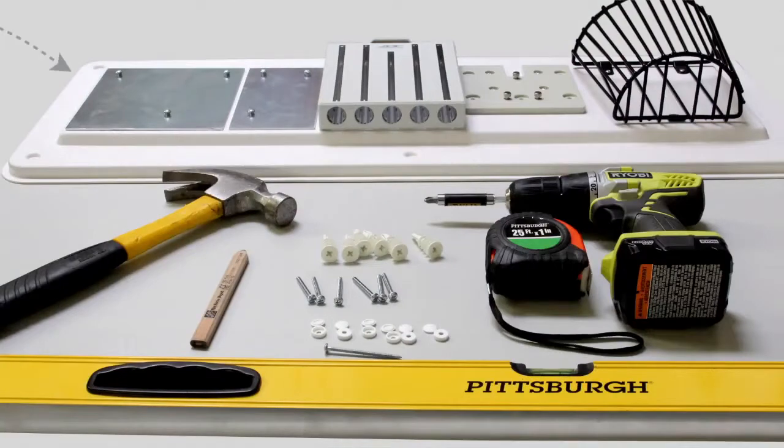Your AdStation comes pre-assembled on the wall board, along with the necessary hardware, including mounting mollies or drywall anchors, wood screws, and screw caps.